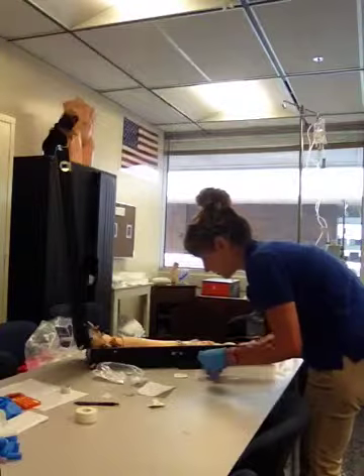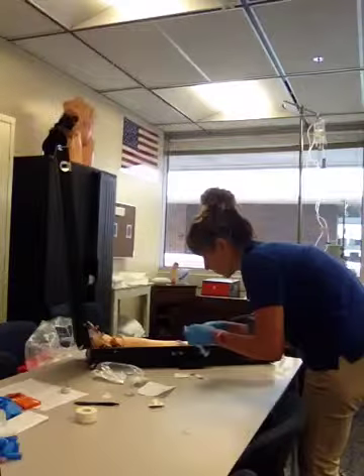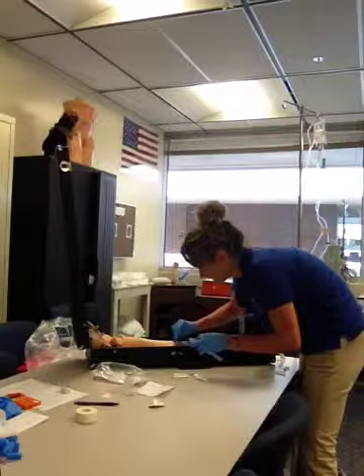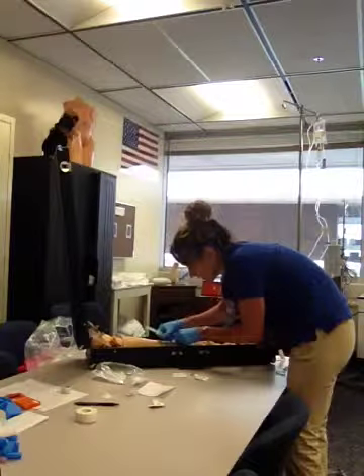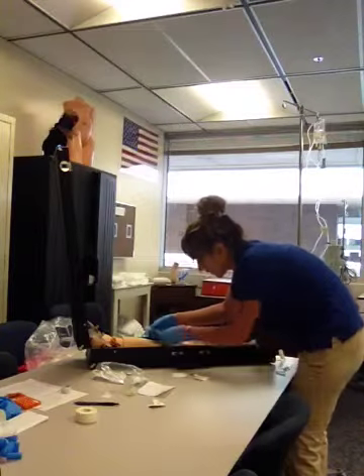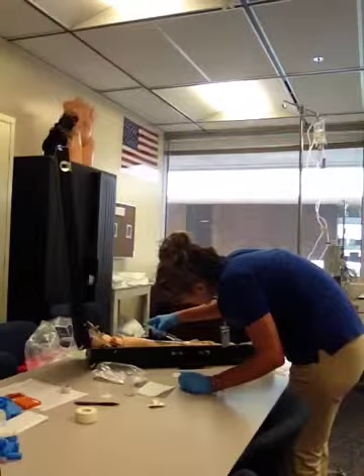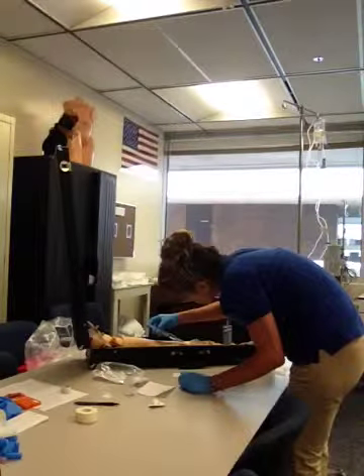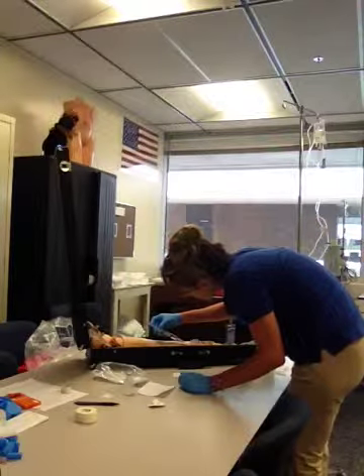So now I'm going to clean the port. Now I'm going to aspirate and when we get blood return, I'm going to do push stop, 3 milliliters of regular saline, and there's no resistance. And does this feel comfortable for you, Mrs. White? And the patient states that she doesn't feel any pain or discomfort.